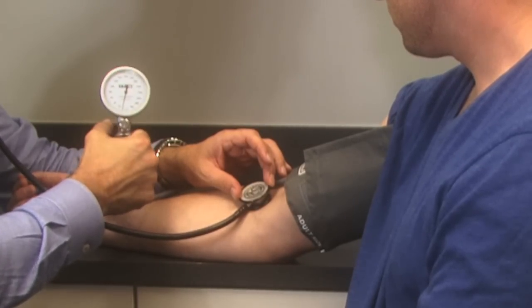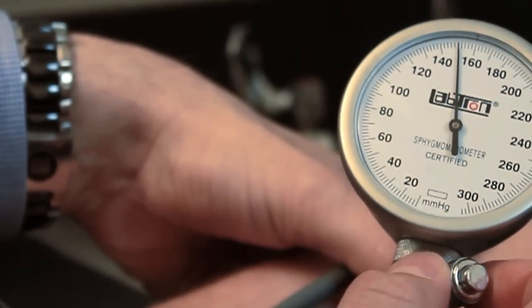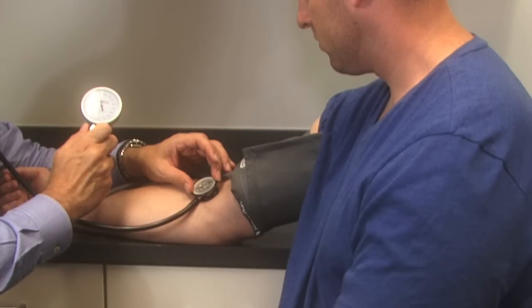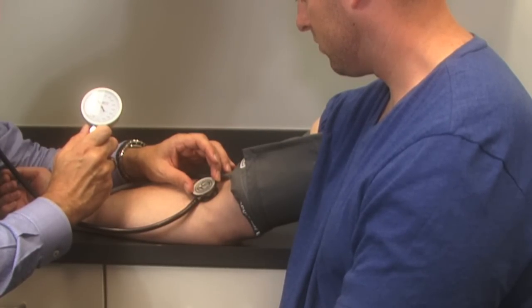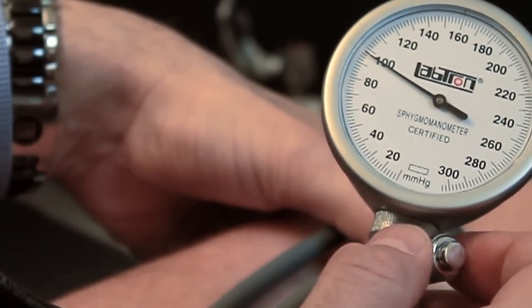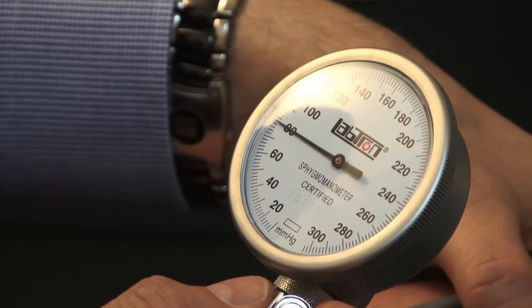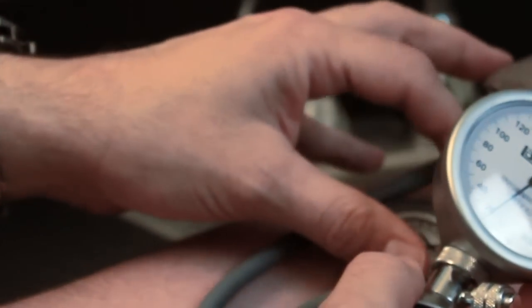The ideal rate of deflation is approximately 2 to 4 mmHg per second. Deflating slowly allows you to listen carefully for sounds. I'm deflating slowly because I'm listening for the first Korotkoff sound. The point at which I first hear that sound — right now about 130 — is the patient's systolic blood pressure. I continue listening, and the point at which the Korotkoff sounds disappear is the diastolic blood pressure. After the last sound disappears, let it continue deflating slowly for about another 10 mmHg, then open the valve completely to fully deflate the cuff.